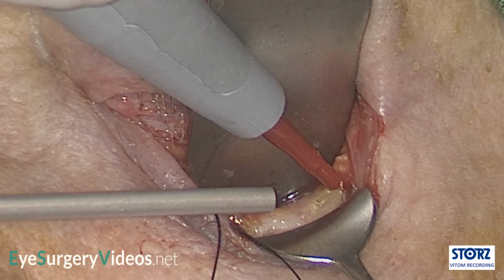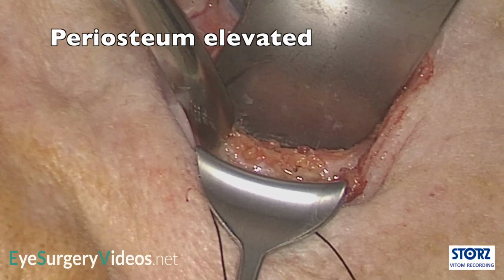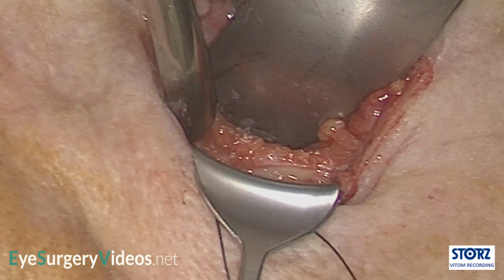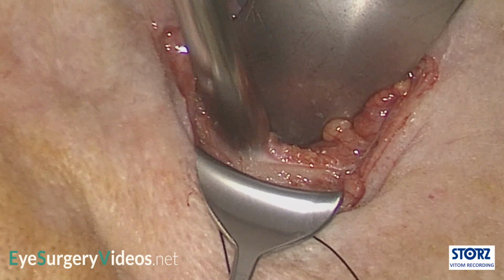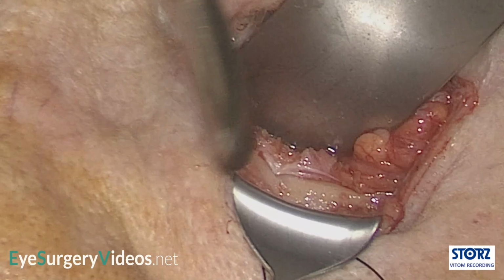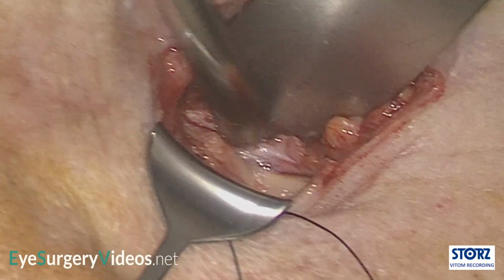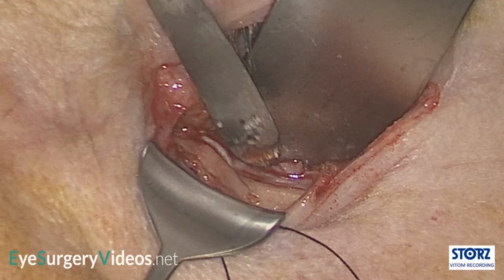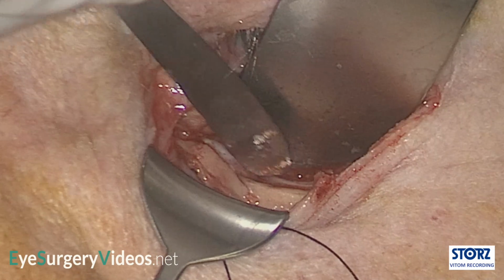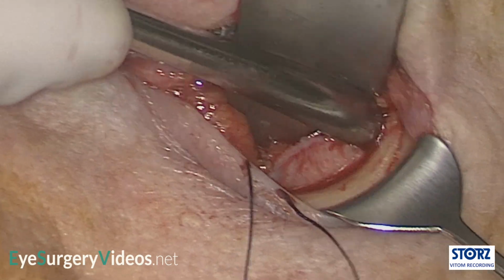A periosteal elevator is used to separate and raise the periosteum of the orbital floor to provide access to the floor fracture. The periosteum is very loosely attached and the plane easily dissected, apart from the strong adherence at the rim. Trapdoor fractures typically occur in the soft, malleable bone of children. These fractures can usually be depressed to allow the herniated tissue to be released and the floor will return to its normal position, and a floor implant may not be necessary.